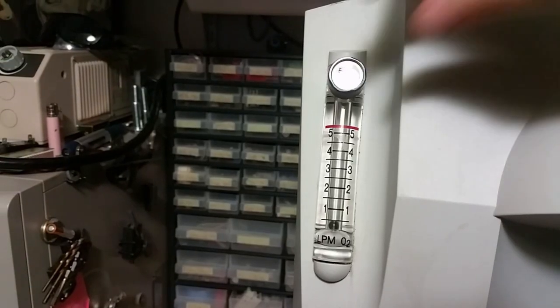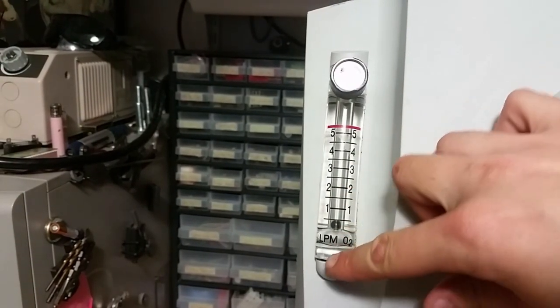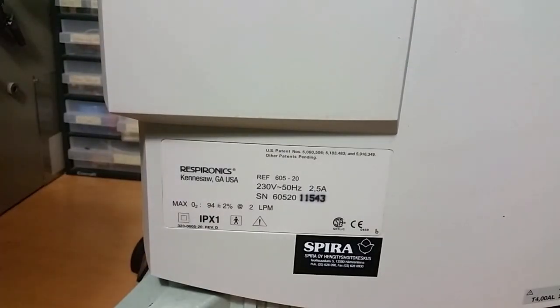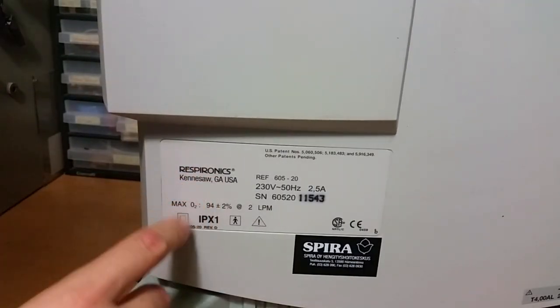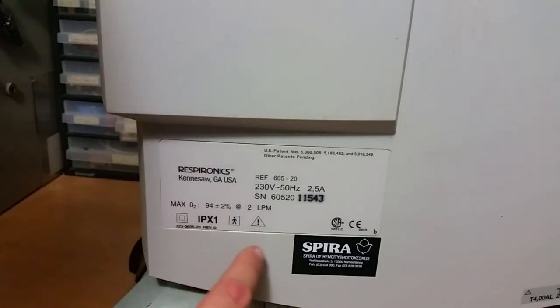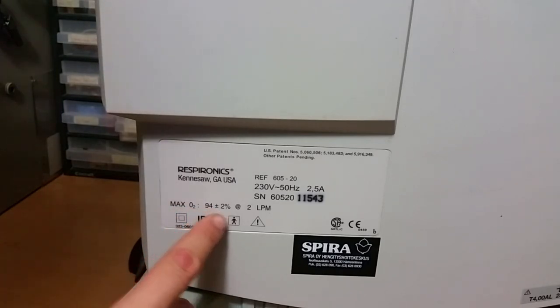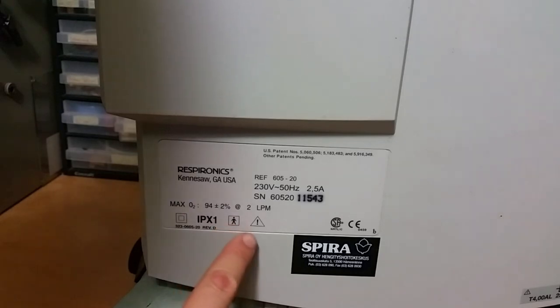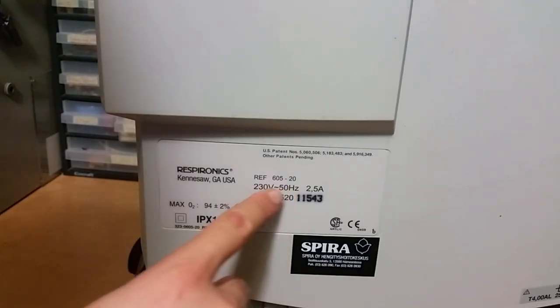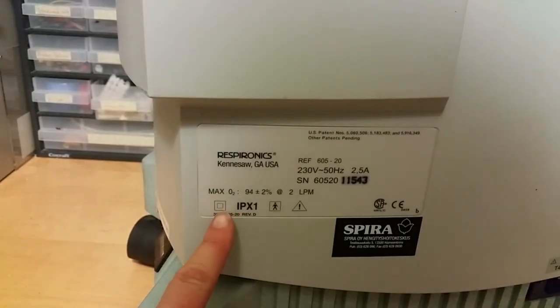On this side we've got an adjustment here, and here you can see the flow in liters per minute. It's a Recipronix, Kennesaw, GA, USA — a USA-made unit. Maximum oxygen is 94% plus or minus 2%. It's IPX1 rated and safe for medical use. We've got 230 volts, 2.5 amps, and it's double insulated.